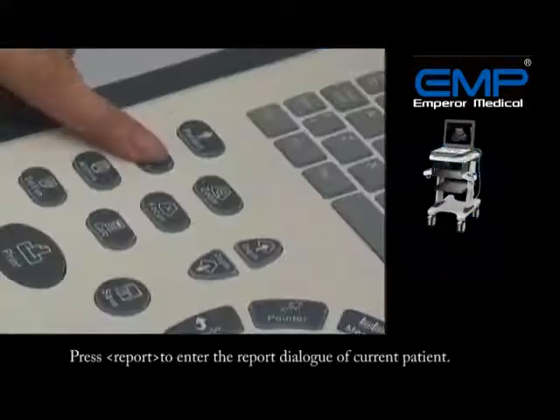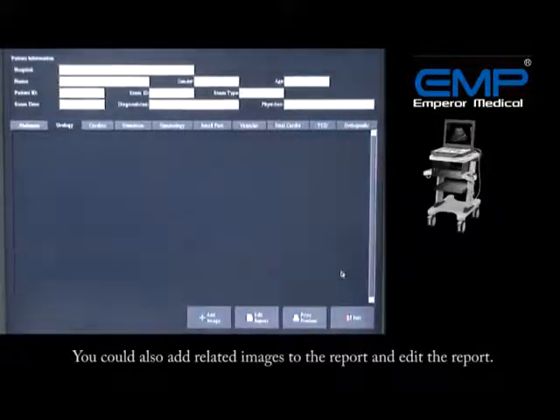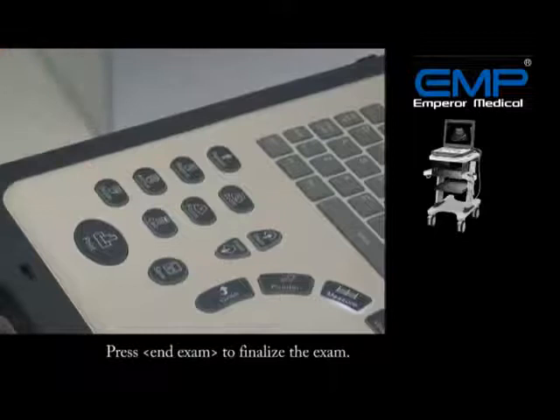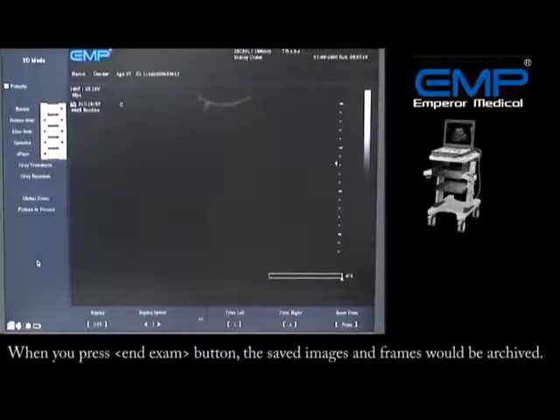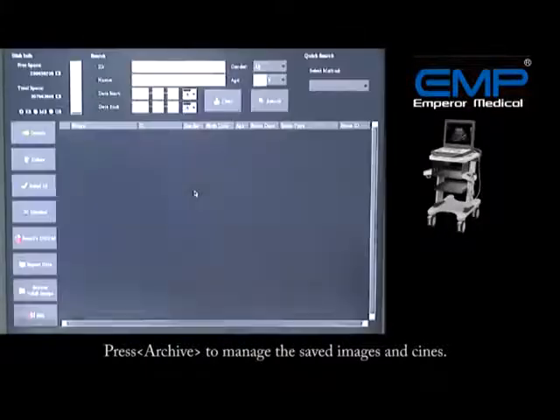Press the Report key to enter the report dialog for the current patient. You can also add related images to the report and edit the report. Press the End Exam key to finalize the exam. When you press End Exam, the saved images and frames will be archived. Press Archive to manage the saved images and scenes.